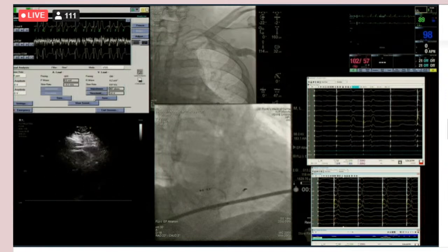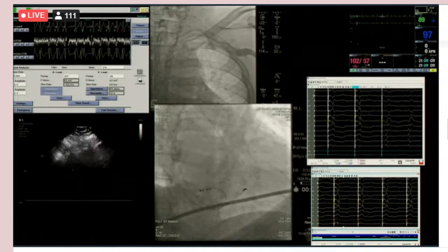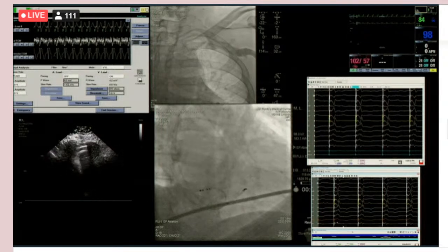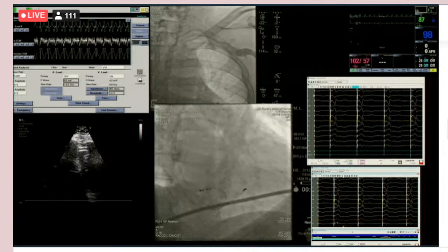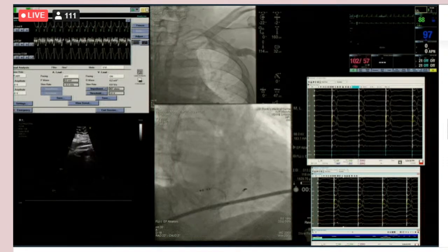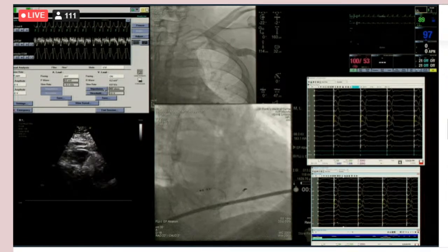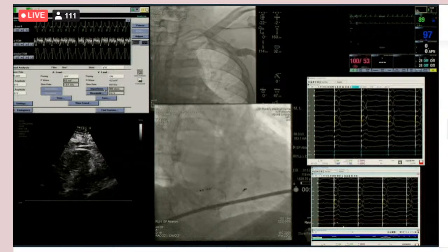Now, Rodney, given that it's tough to predict who's going to develop a cardiomyopathy from RV pacing, and probably the majority of people don't, what's your patient selection criteria for a left bundle pacer? So that's an excellent question. It's a little bit trickier. Obviously, there's more nuance to it compared to just a standard right ventricular lead. Generally, as I'm sure you know, if you put a lead in the right ventricle, particularly that's apical, we hope it doesn't pace. We have all these different software designs to try and prevent forced pacing in the right ventricle, because apical pacing is so artificial and potentially a risk for creating a pacing-induced cardiomyopathy.